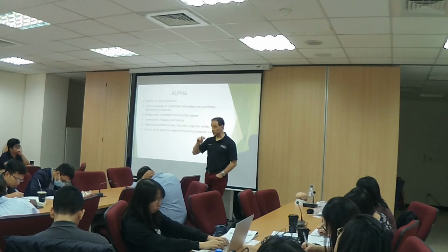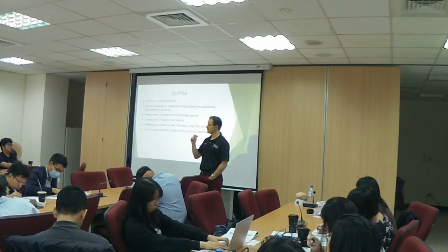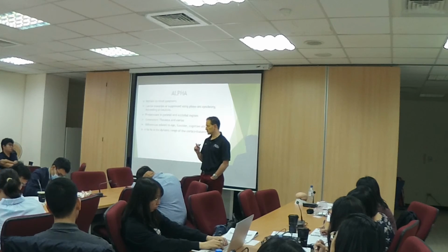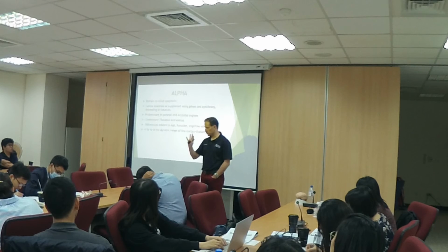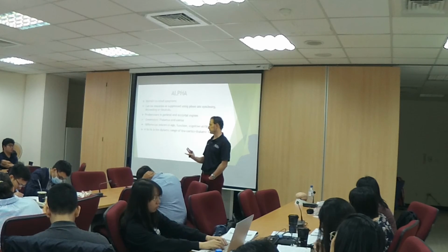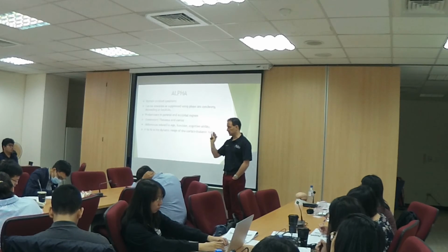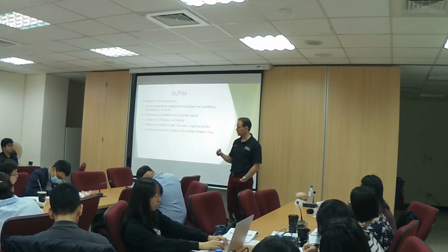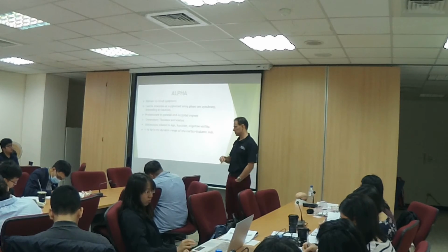The normal attrition rate for the peak alpha frequency is 0.5 hertz per decade. So to lose 0.5 hertz per decade is within the normal range. If you're losing more than 0.5 hertz per decade, you have a problem. You have to look at dementia. You have to look at some kind of neural degeneration disorder.